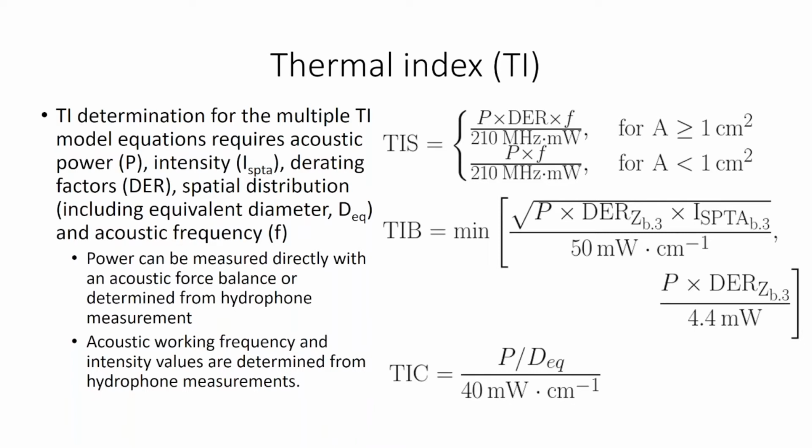As you may have seen in the mechanical index, the frequency parameter shows up in many of the parameters.